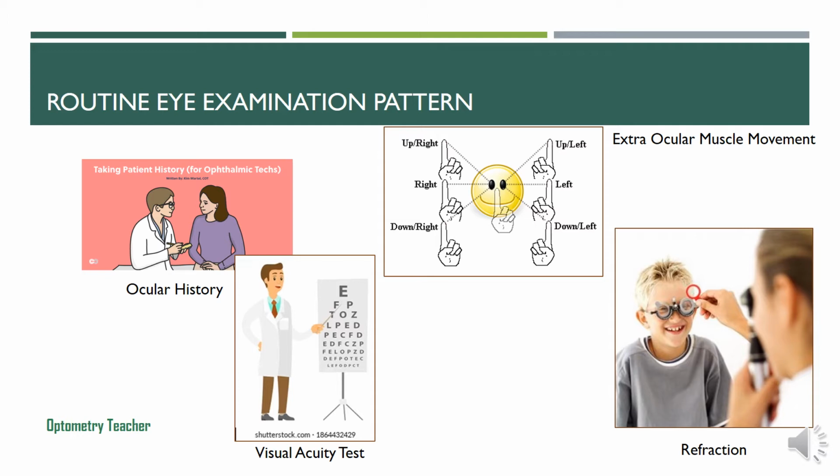And next we end up with checking their visual acuity. Visual acuity is the most common test that we need to do in every single visit for a patient. So it's very important to have the visual acuity tested both for distance and near, and then if they're using glasses or contact lenses, we need to check it with glasses and without glasses.